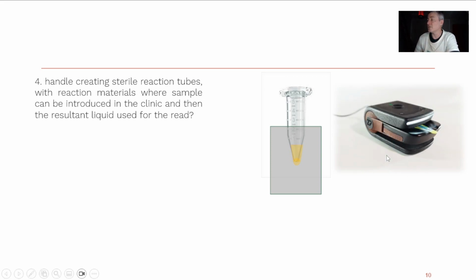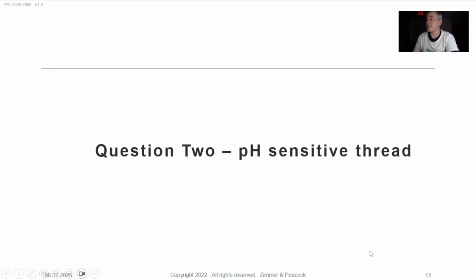Then you can use our device, take a sample from there, read it, and see whether that pH shows a positive, unfortunately, or a negative. A positive in a LAMP assay is not necessarily a good thing for the patient, but a negative may be. It could be a sexually transmitted disease, etc. So the quick answer is we have worked with that kind of workflow in the past.